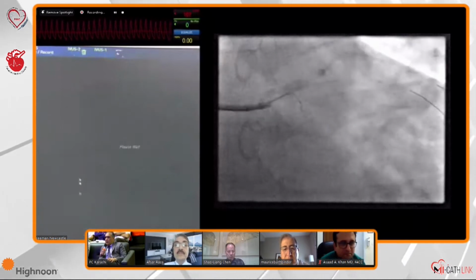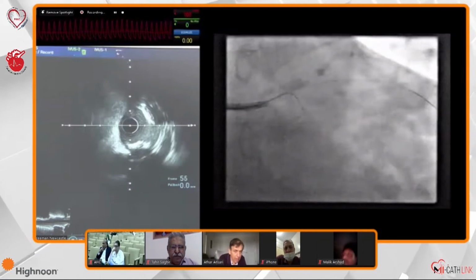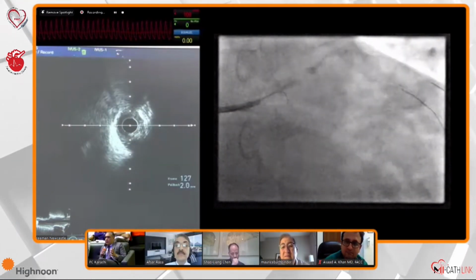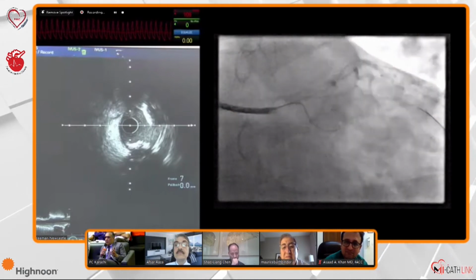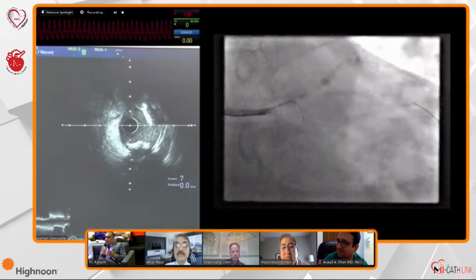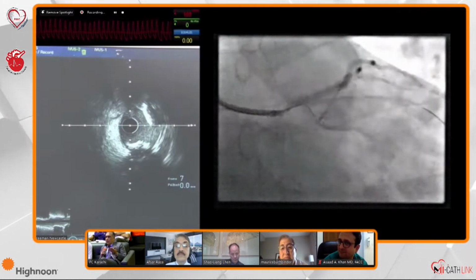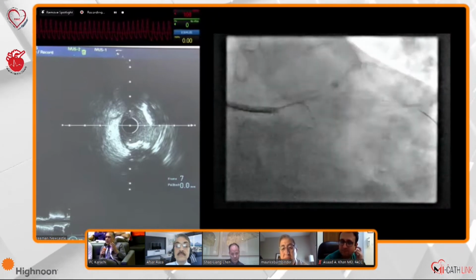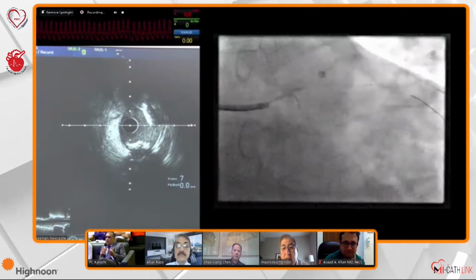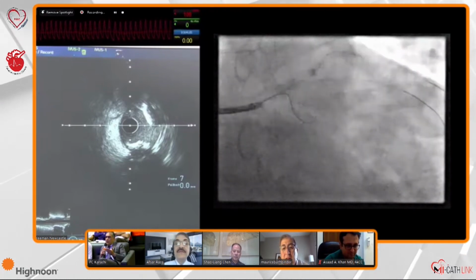Sorry to interject. My question is that in a poor country like ours, it's quite obvious that you can't intervene in the circumflex. If you've decided on a two-stent strategy, you're not going to stent the circumflex and get away without much problems in the LAD. You're going to have something, so it has to be LADs. And so, is IVUS absolutely necessary up front? Is it just for sizing, or because you know that it's significant? You would need to intervene in the left main LAD.